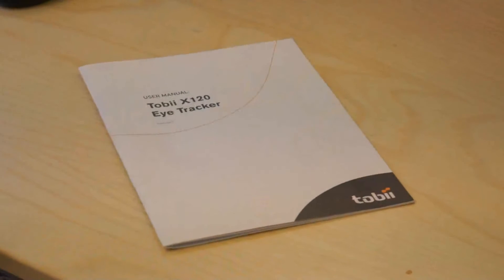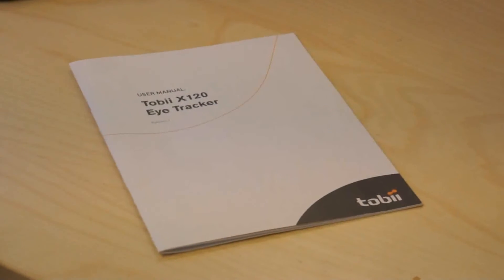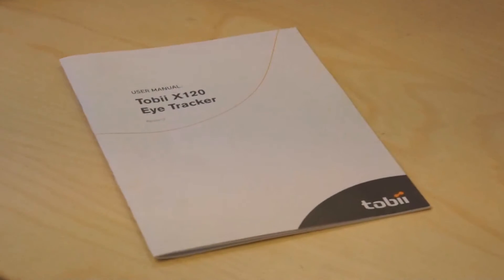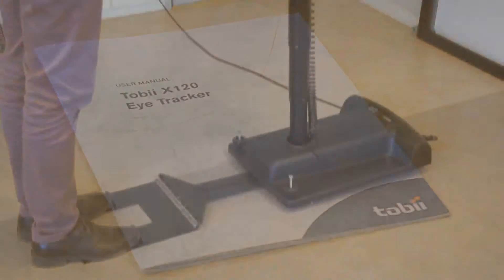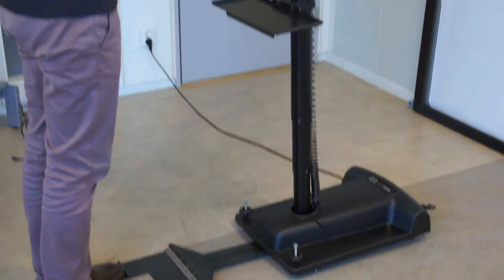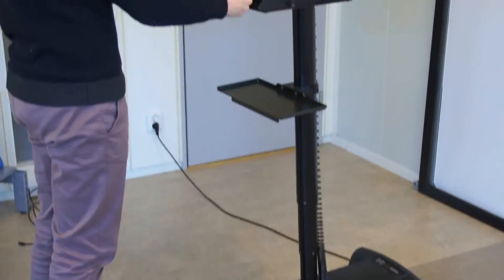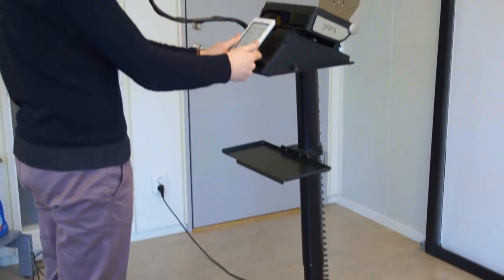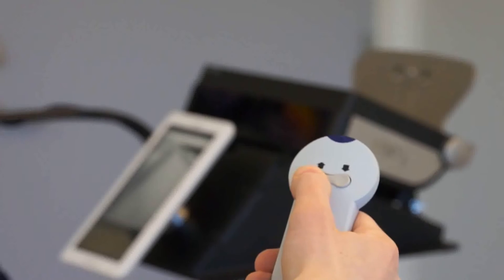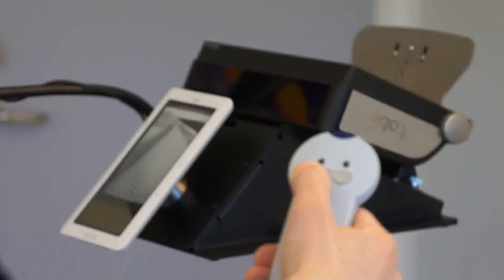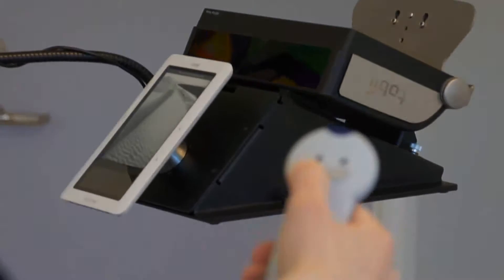For details about the physical object setup, please refer to the included manual. In this video, we will be using a Tobii floor stand. This is not a requirement but allows for easy height adjustment and improved ease of use.